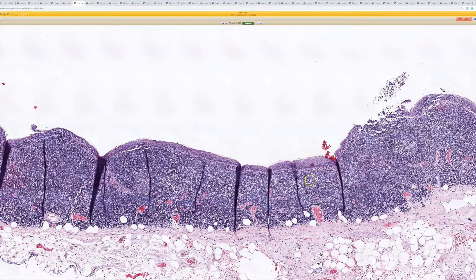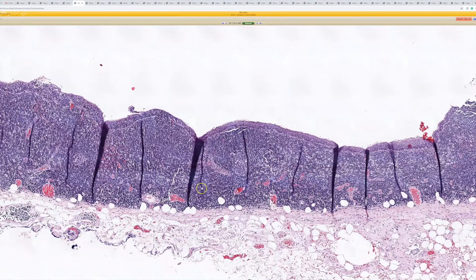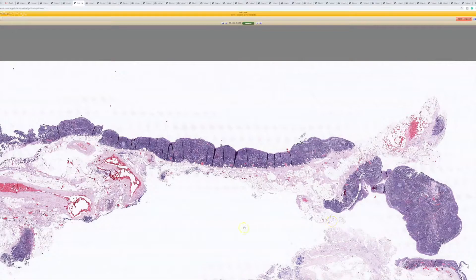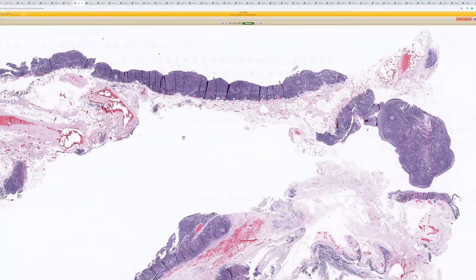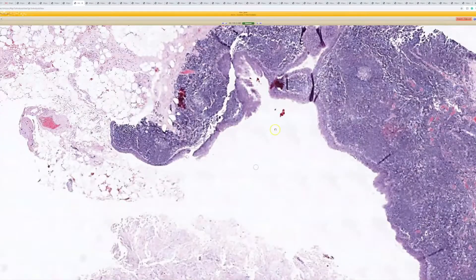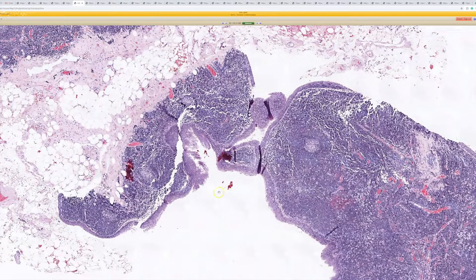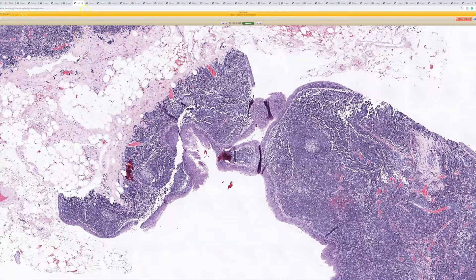I'm certainly no embryology expert — it's a lot more complicated than I can remember. But that's an example of a branchial cleft cyst, and something I only rarely have seen in practice. Maybe they all go to pediatric pathologists or something, but they do not come across my scope very often. So: stratified squamous, dense lymphoid infiltrate, below the angle of the jaw — branchial cleft cyst.